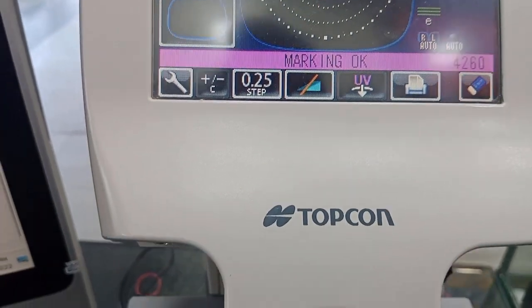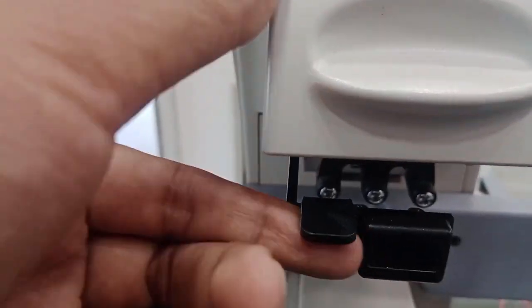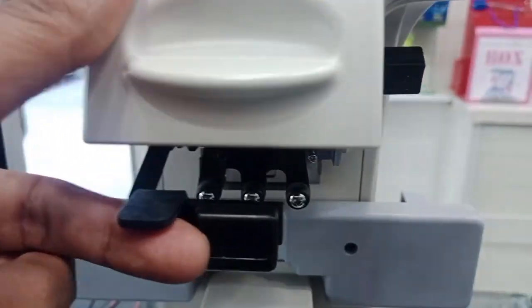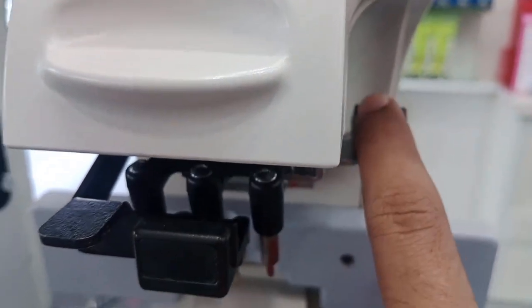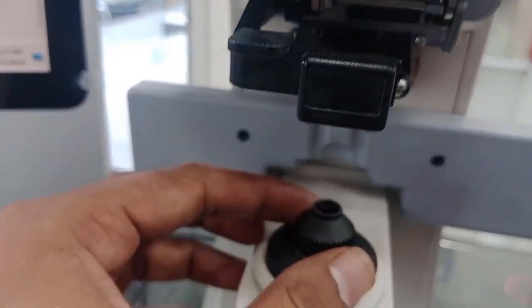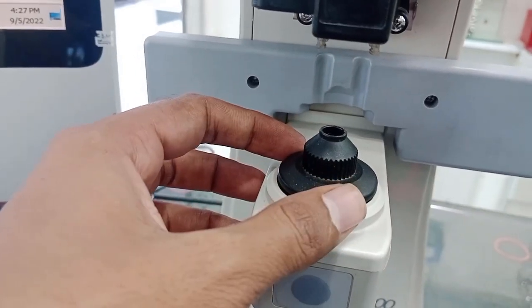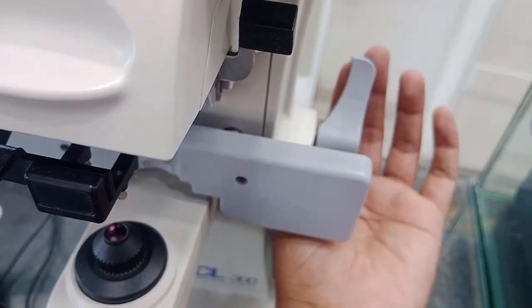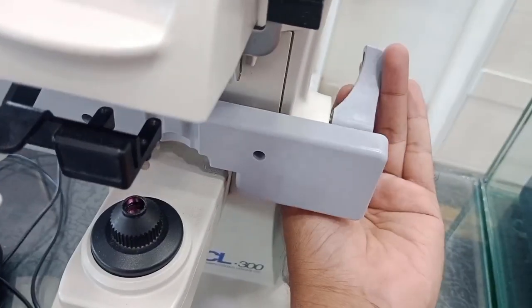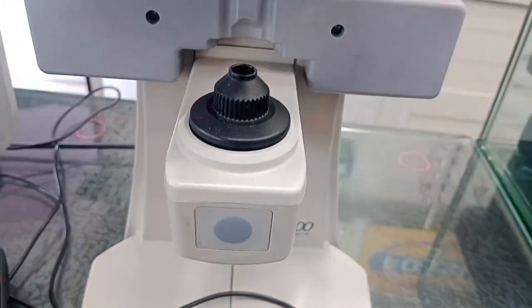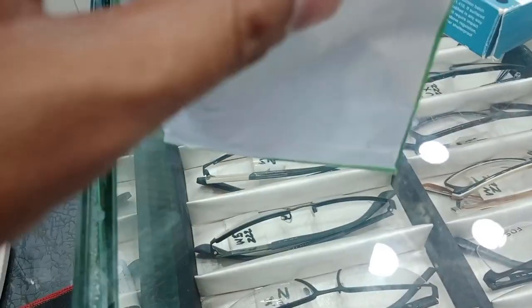Now we will look at the different physical parts. This is the lens holder where we fix our lens. These are the axis markers — you can mark your axis with these. This is the lens bracket where we place the lens or blank. This is the lens lever, which fixes the blank or spectacles so they are unable to move.